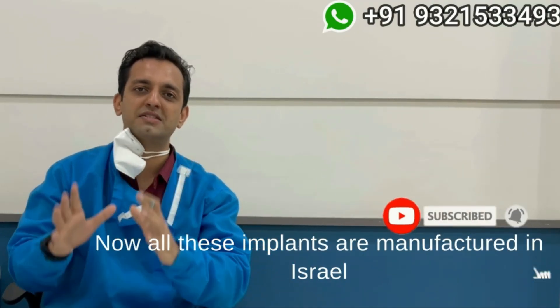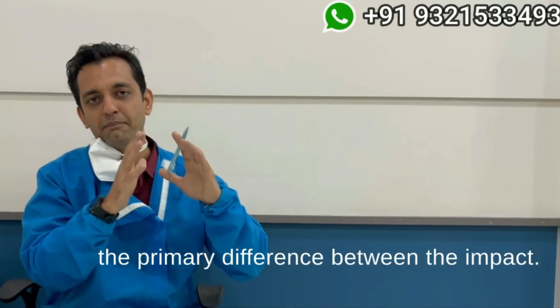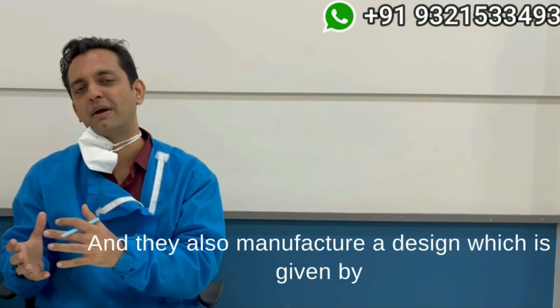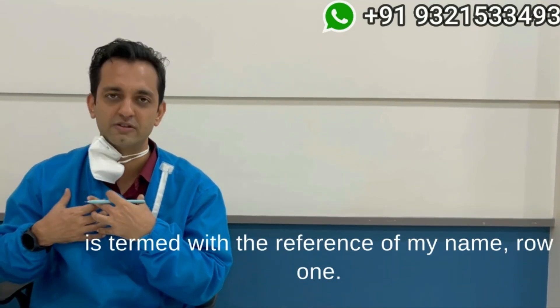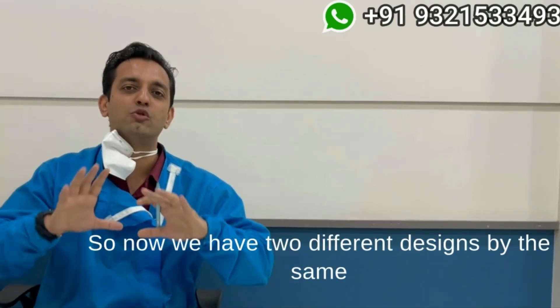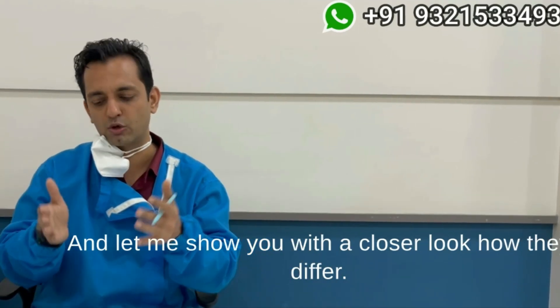All these implants are manufactured in Israel with state-of-the-art technology. The Impact company manufactures its own single-piece implants, which they call the Impact implants, and they also manufacture a design given by me from my years of experience, termed with the reference of my name Rohan — so it is the R-line series. We now have two different designs by the same parent group: the Impact implants and the R-line implants.